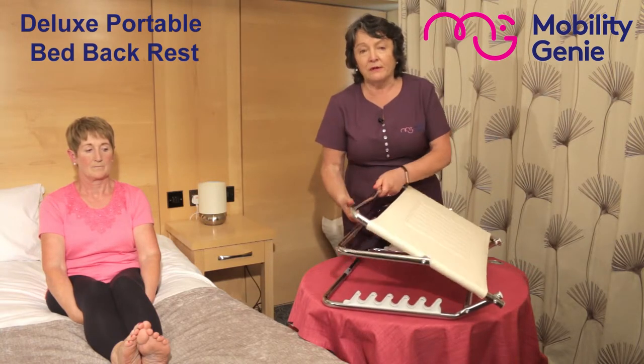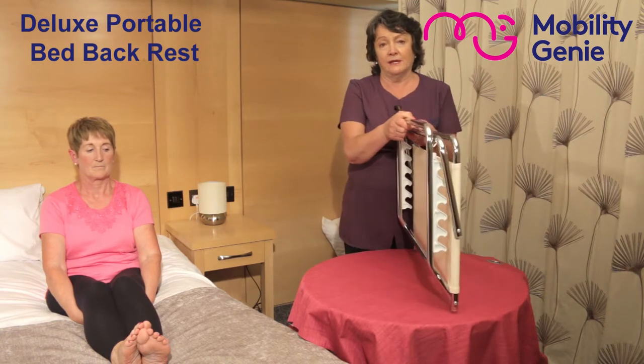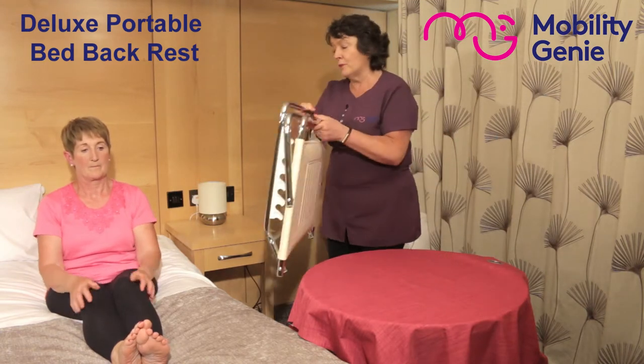It's easily foldable for storage and transport. For the measurements, please refer back to the page. I'm now going to demonstrate it here with Margaret in the bed.